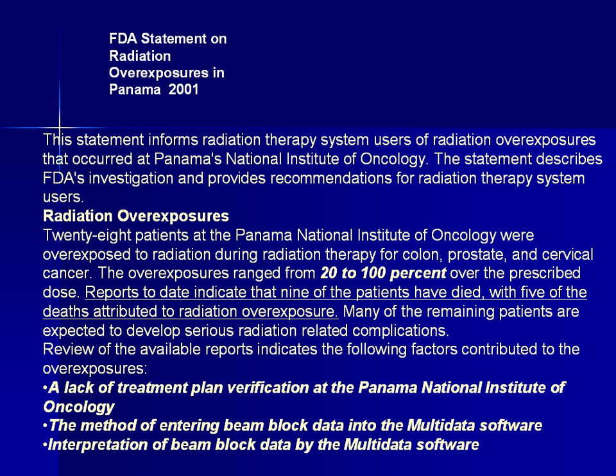But again, that's lack of treatment plan verification. So the machine was brought in, plugged in, did some beam fitting, and there was no verification done to make sure that the treatment planning system was acting correctly or they were using it correctly. And as George said, the method of entering the beam block data was really the main problem.